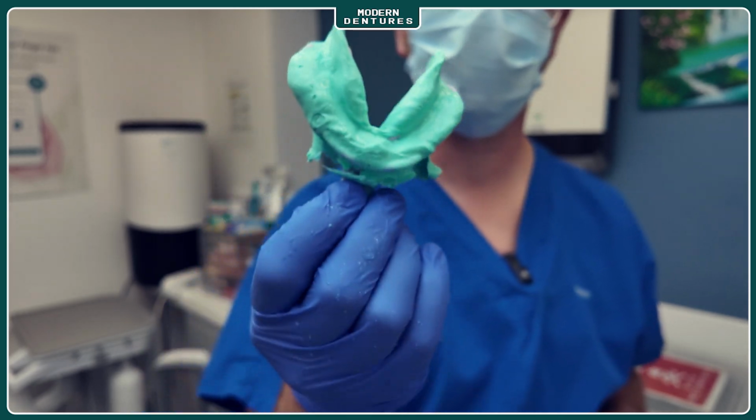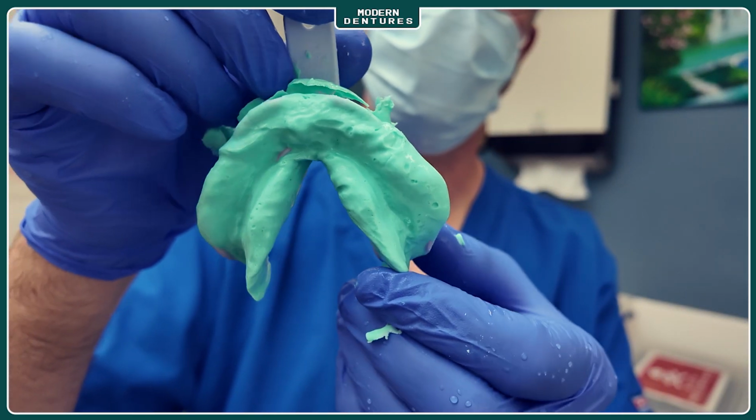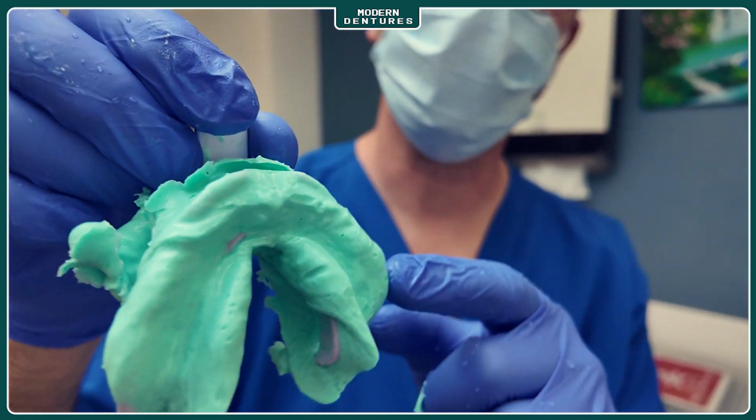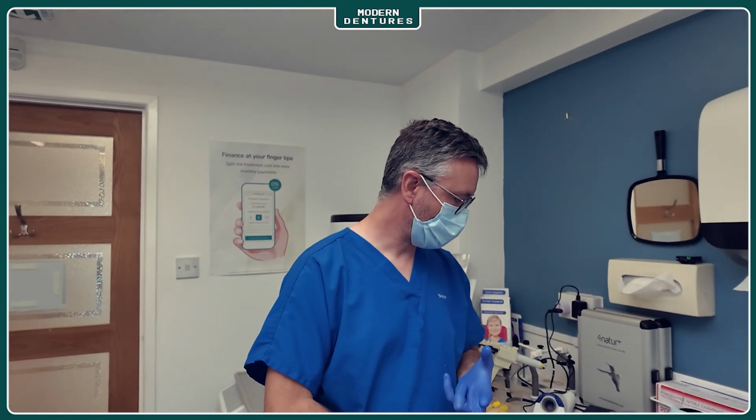A lot of low impressions that I see, there's not enough alginate put in the tray, and so then they're underextended. You don't get all the sulcuses, and then it makes it very difficult to make a special tray on it. So the other thing I like to do at this stage is take the shade and the mould of the teeth as well.